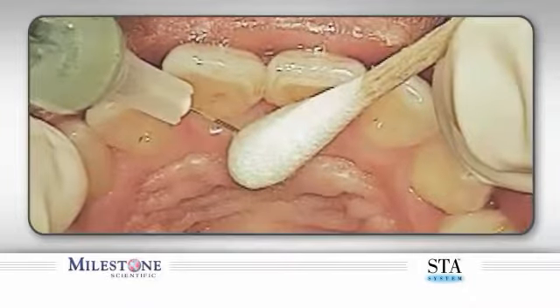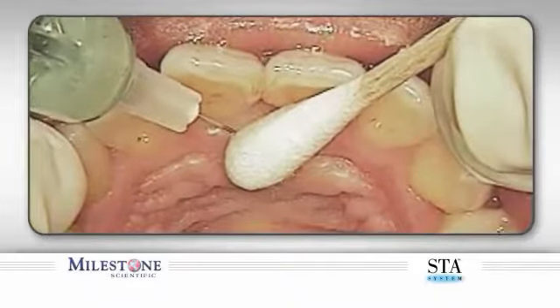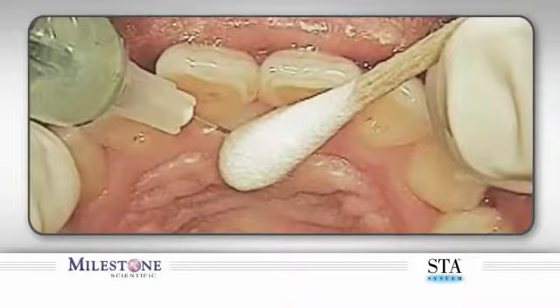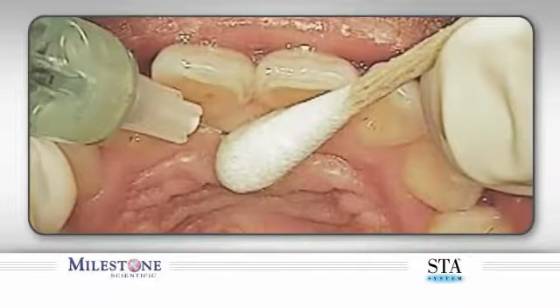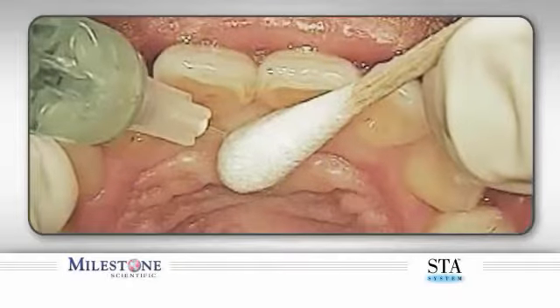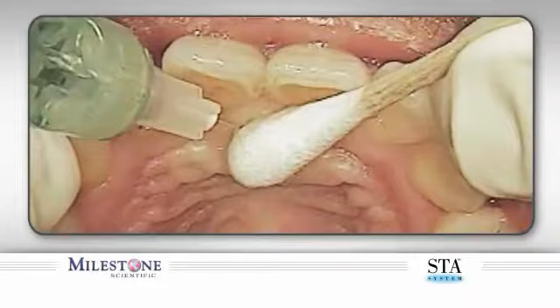After the papilla has blanched, reorient the needle more vertically to gain entrance to the nasopalatine canal and continue to advance the needle very slowly, while simultaneously rotating with bidirectional rotation. Advance the needle within the incisive canal 5 to 8 millimeters. All movements must be performed very slowly and gently. Do not move the needle more than 1 to 2 millimeters forward each time.